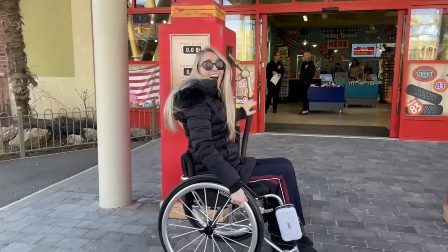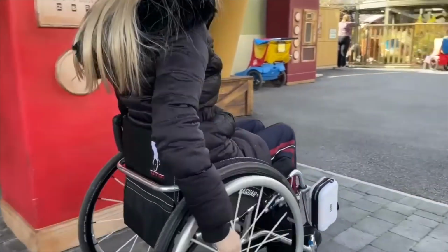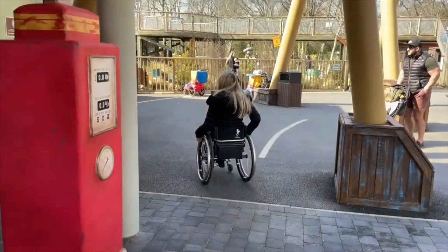What advice would you give someone choosing a new wheelchair? I would advise the person to do lots of research and be aware of the different options available before you buy a wheelchair. I would say watch Wheels No Heels on YouTube because she's got loads of helpful videos to help you decide what wheelchair is best for you. Also, try a chair before you buy it. Even though the trial wheelchair may not be your correct dimensions, it will still give you an idea if it's something that will be suitable for you. It's important to remember that everyone's different, so what works for one wheelchair user may not work for you.